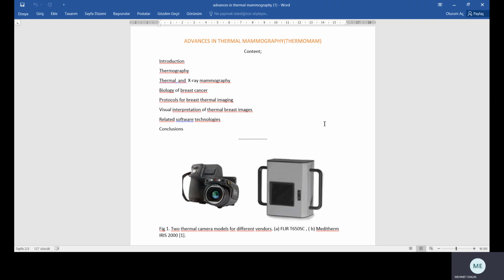Additionally, the clinician can manually identify the vascularity in the breast by looking at the grayscale thermal image, which is then used by the tool to categorize the subject into 5 groups. The tool defines assessment criteria called the Breast Infrared Assessment System, BIRAS, with which they categorize the images into 5 groups, with BIRAS 1 being low risk and BIRAS 5 being high risk.